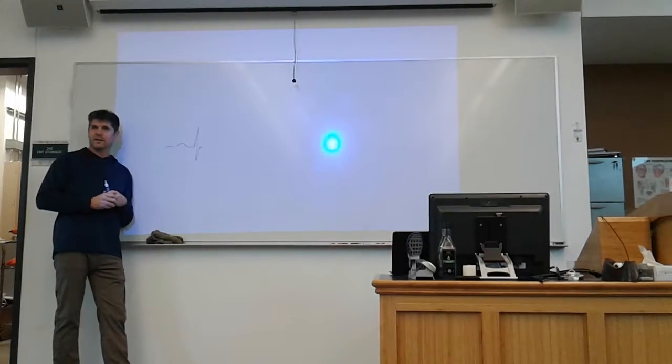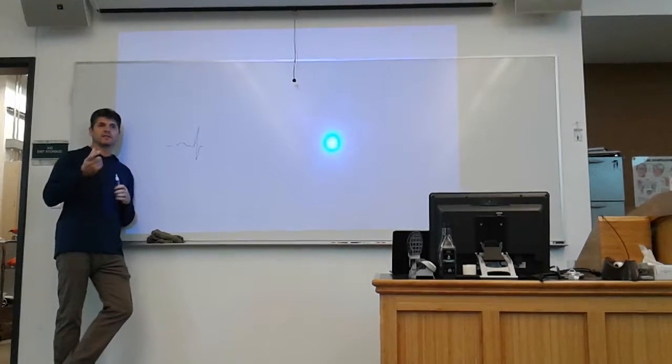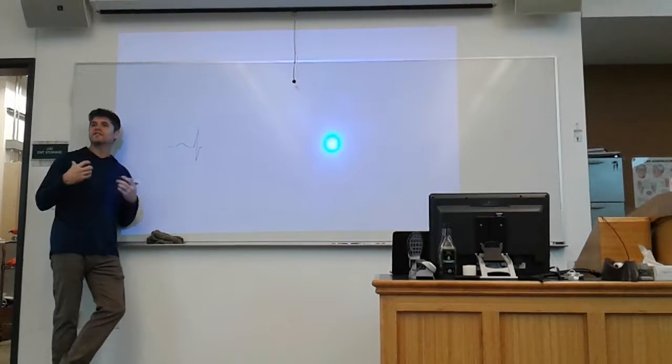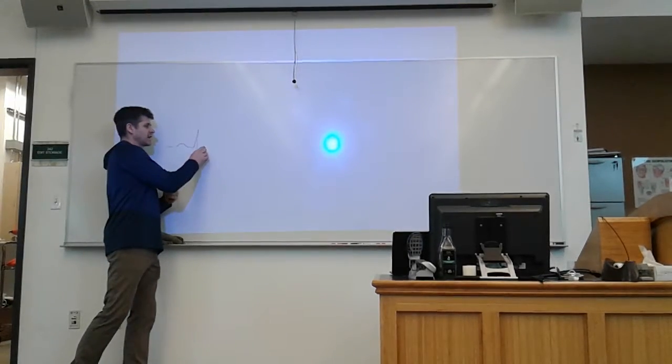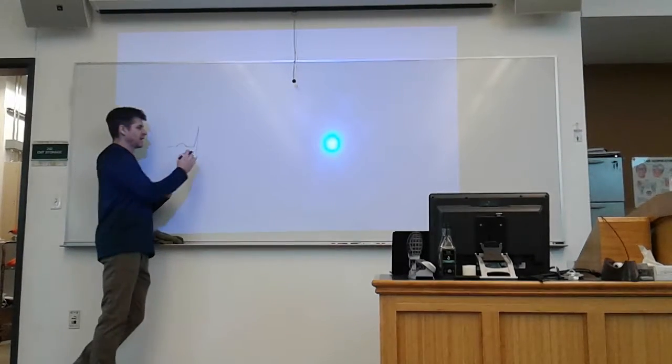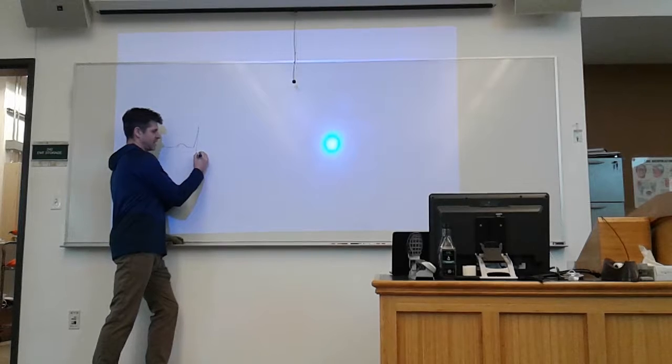Does that make sense? Therefore, the repolarization system starts working differently. We start seeing it differently.